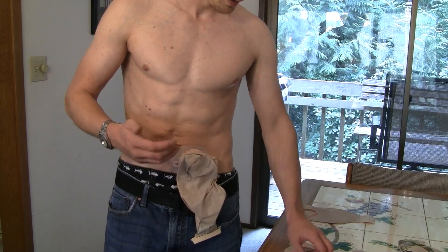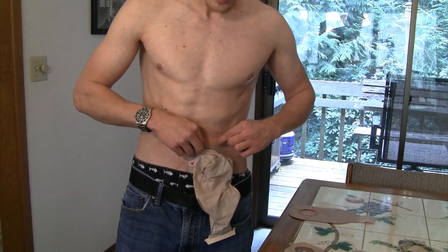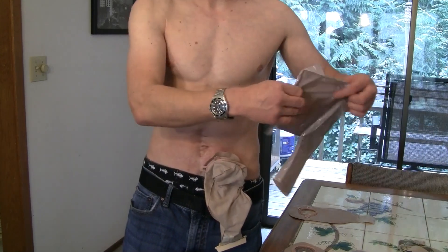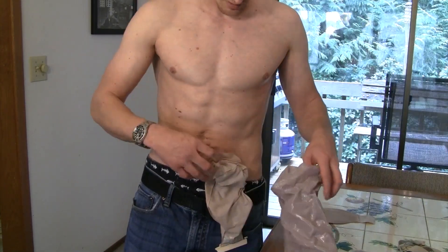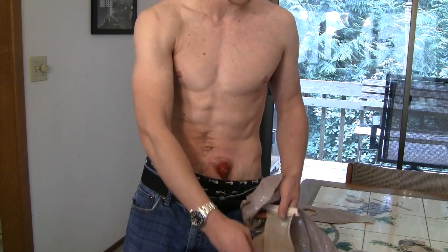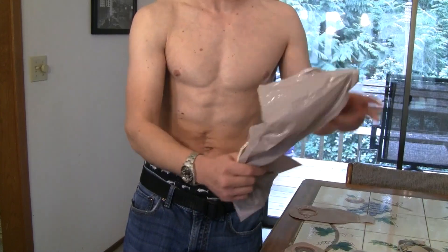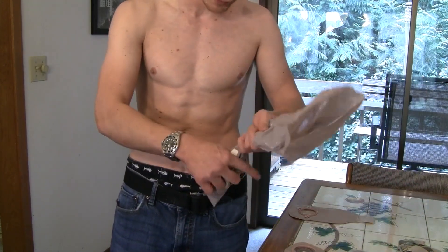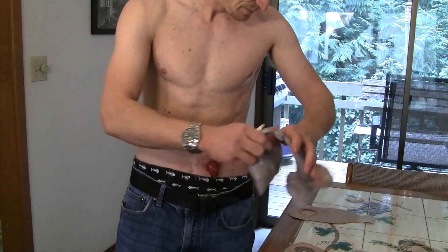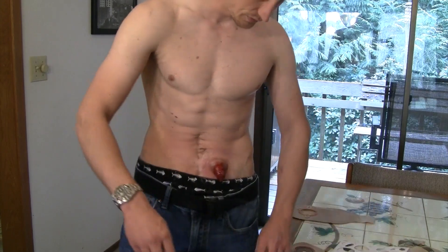I highly recommend getting a mirror to look at the bottom side of your stoma. I was completely ignorant — I couldn't see it and had no idea anything was going on, and you can't feel the sensation of the wafer cutting through your stoma. Wish me luck — I've been drinking coffee, so this could go horribly wrong.